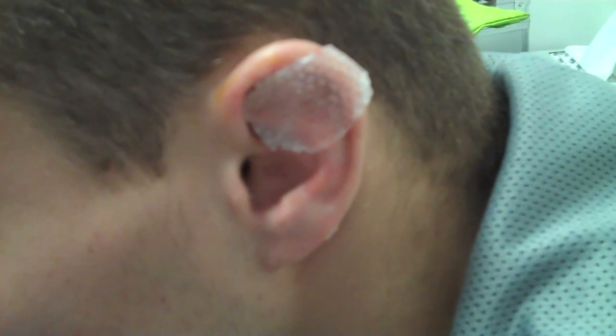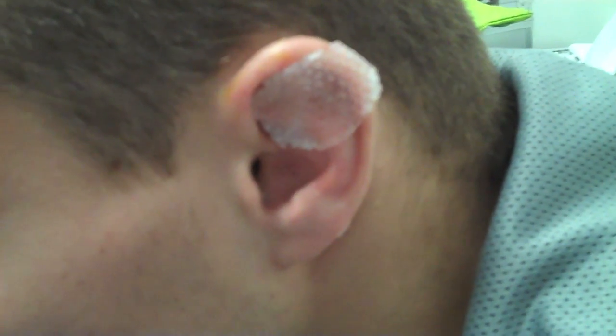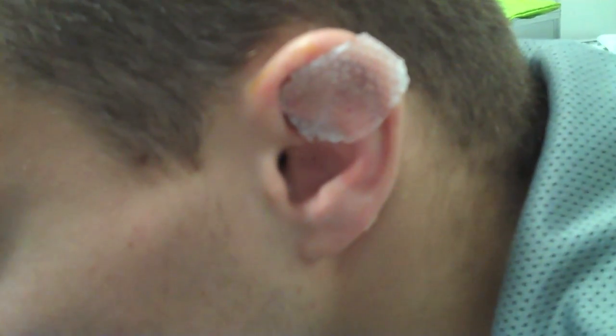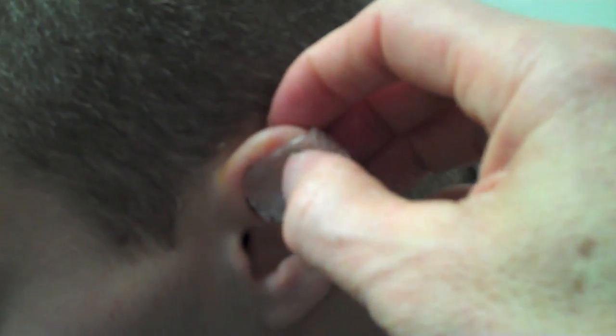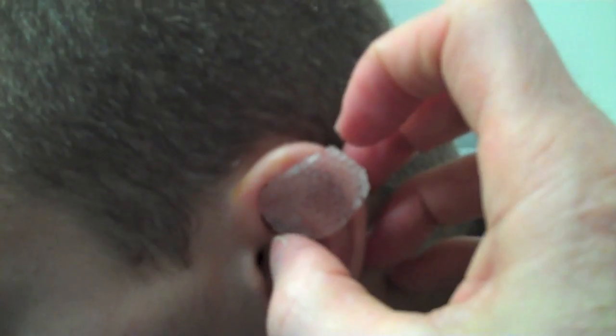This is right after the application of the heat-sensitive ear dressing. It's being contoured to the ear as it cools, and this will stay on for about a week before replacing it with the other dressing.